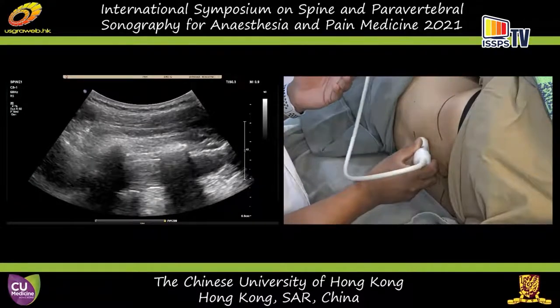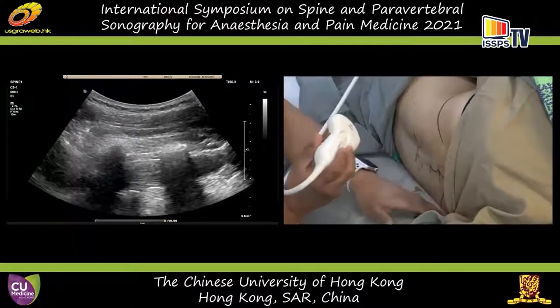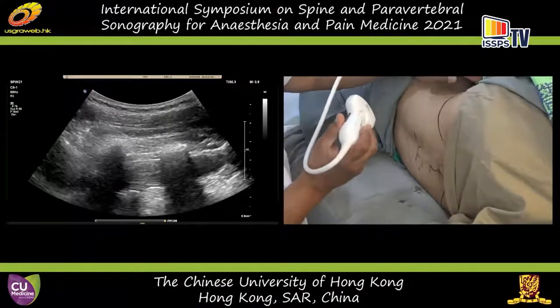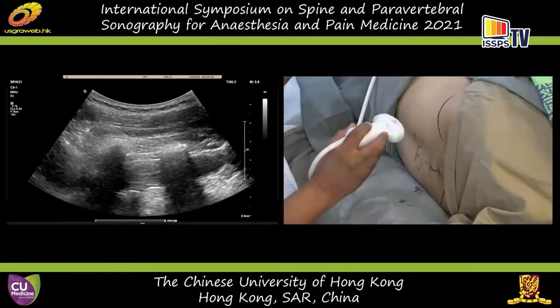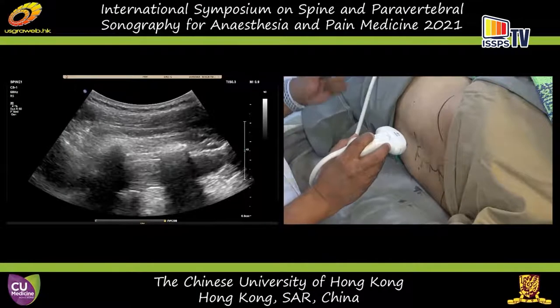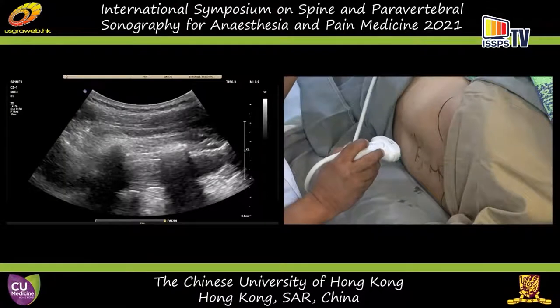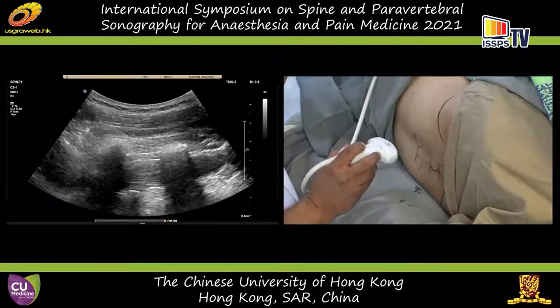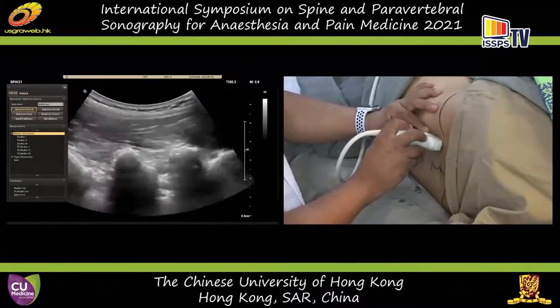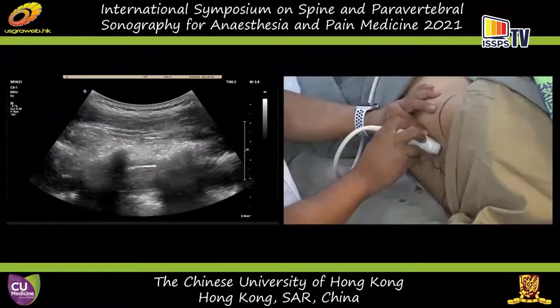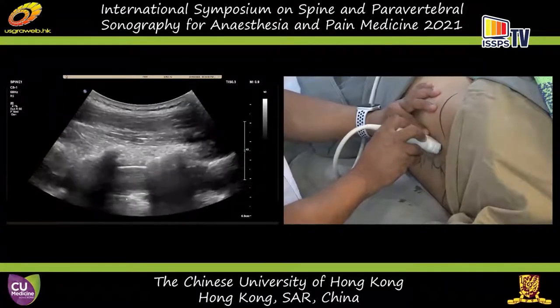However, this is a young man — a volunteer — and this is not the real scene when you are in the operating room in the real world. You will find that patients have much narrower interlamellar spaces and much narrower acoustic windows. A pearl: look for the anterior complex, because it is a good indicator of whether there is a narrow space or not.